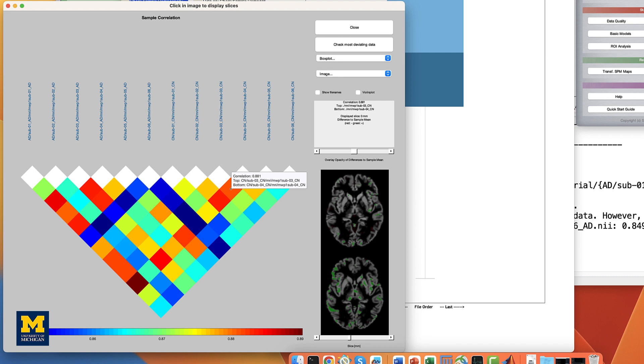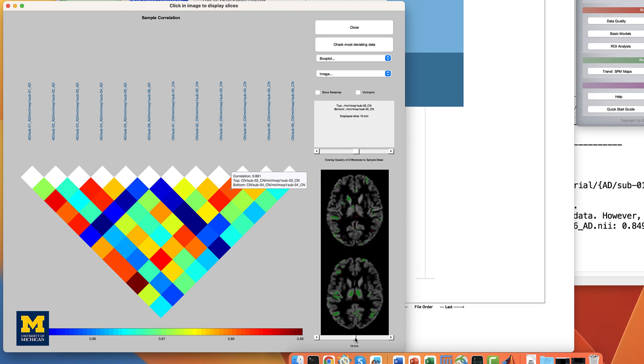Most of these correlations will be somewhat randomly spread throughout the brain, which is normal. You can use the slider below the brains to change the slice number you're looking at, or you can change the slider above the images to change the overlay opacity of the green and red colors.